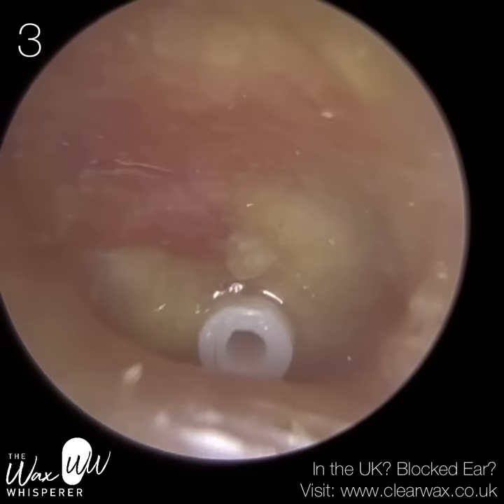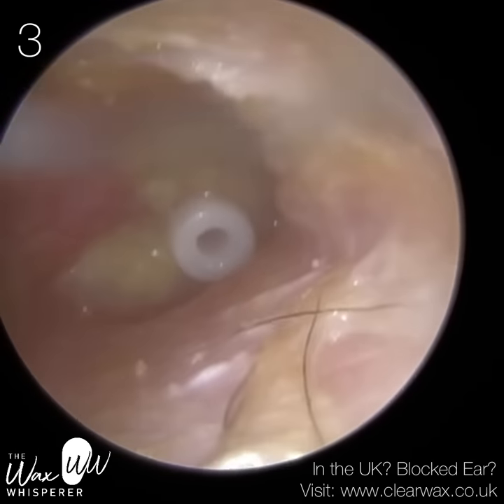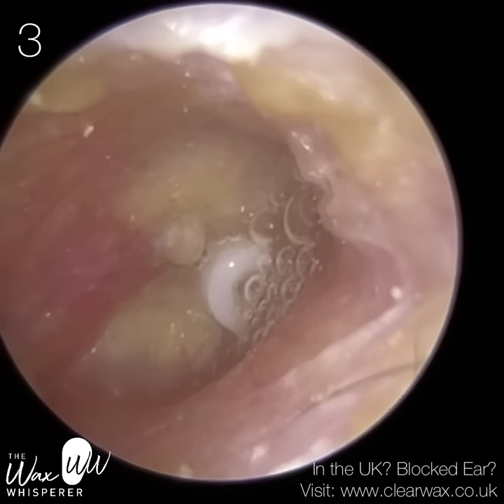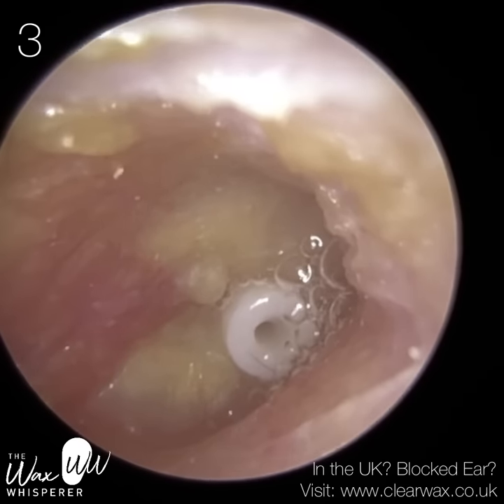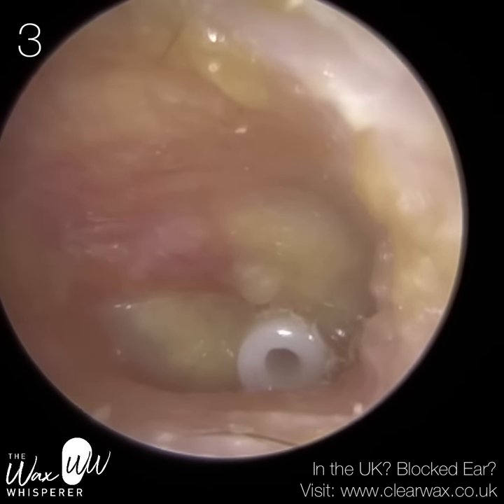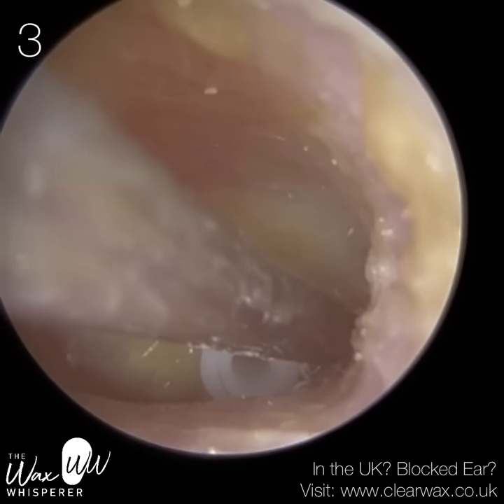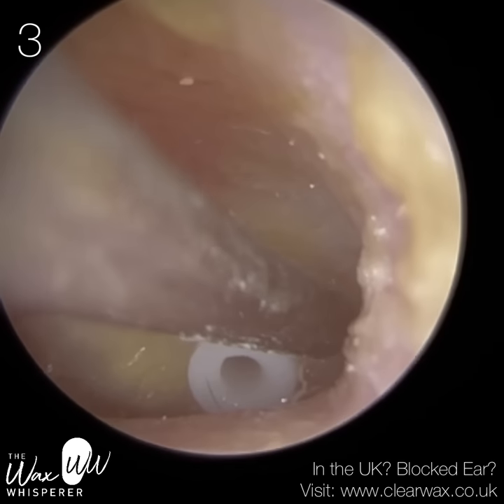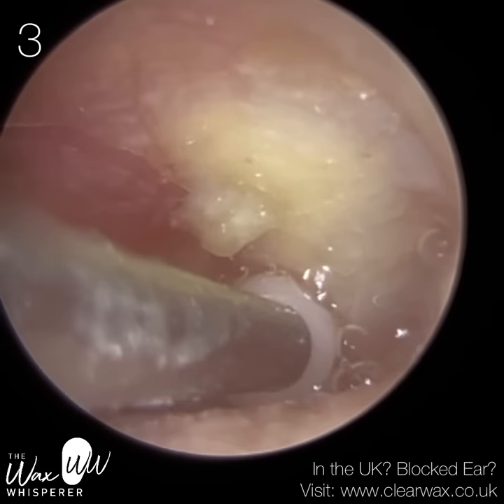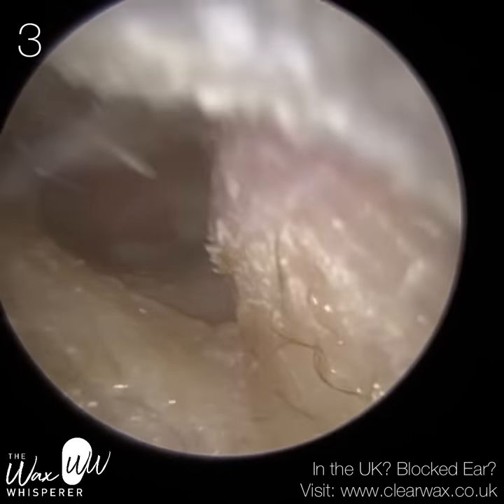You can also use shadows and ear anatomy for depth perception — and simply going closer with the endoscope gives better depth perception. My auntie again used the Otovent nasal balloon and squirted fluid out of her middle ear, which collected in a puddle — you can see all the air bubbles. Some fluid was getting sucked back in because I was asking her to swallow at the same time. I asked her to stop: just blow into the balloon, hold her breath, move the balloon away, then open her mouth without swallowing — the swallowing was having the opposite effect, sucking fluid back in.